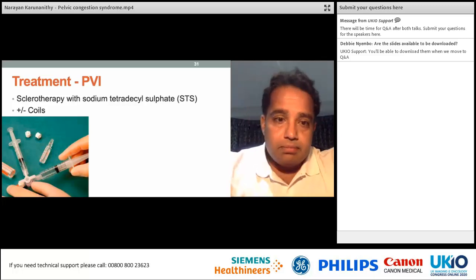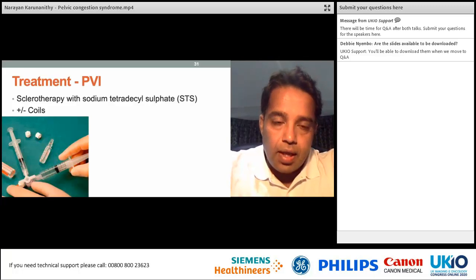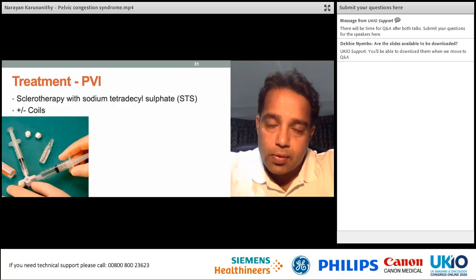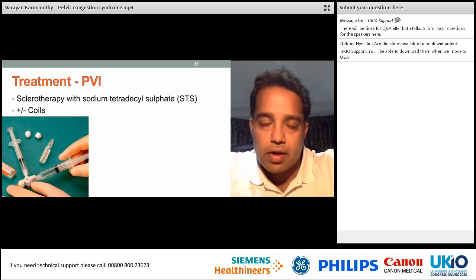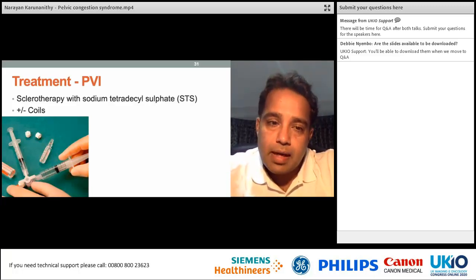Now, there are various reports of people using lots and lots of coils. Our practice has very much moved to one where we primarily use liquid sclerosant agent, with very sparing use of coils. And I'll come on to our outcomes in a minute.